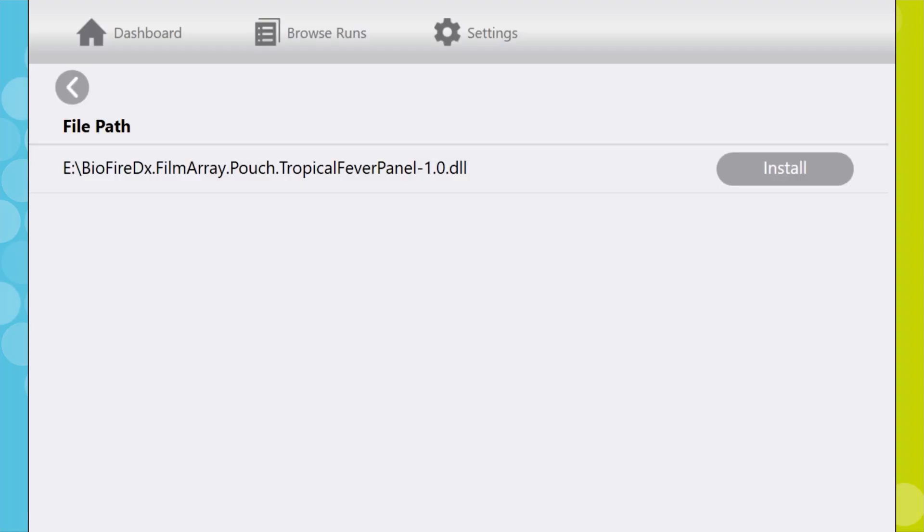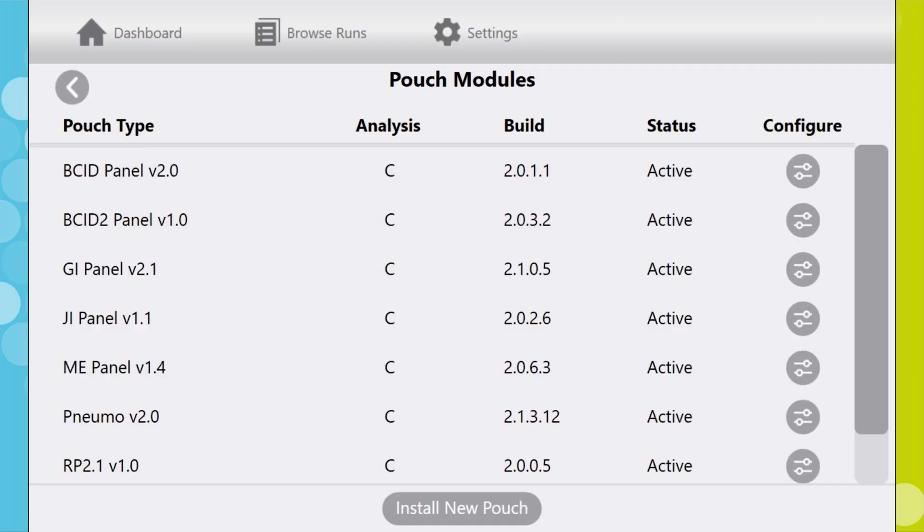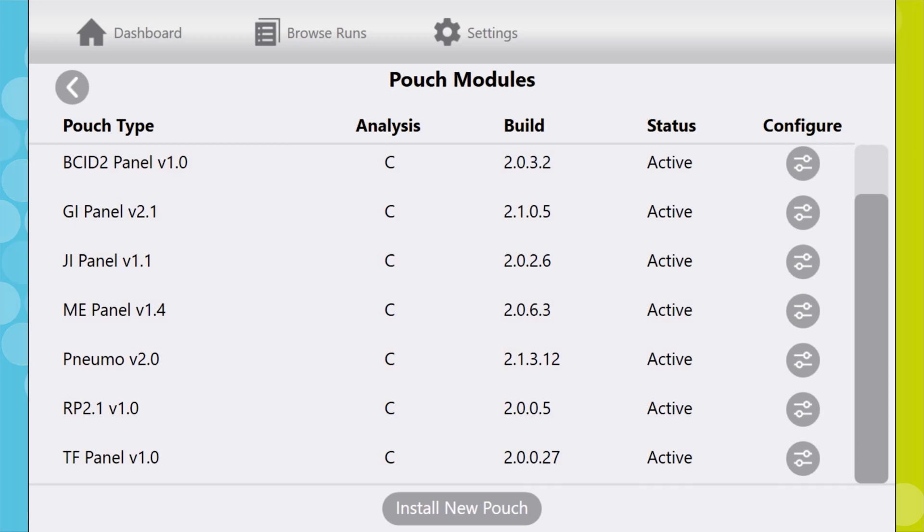The Tropical Fever panel requires a pouch module software update to run. This software can be downloaded online and self-installed.